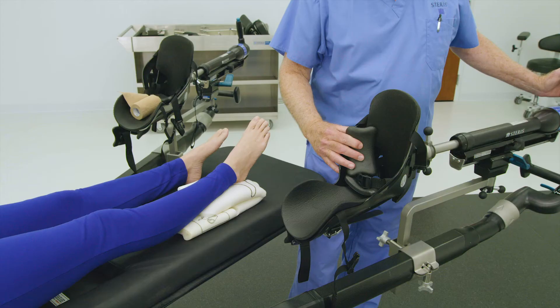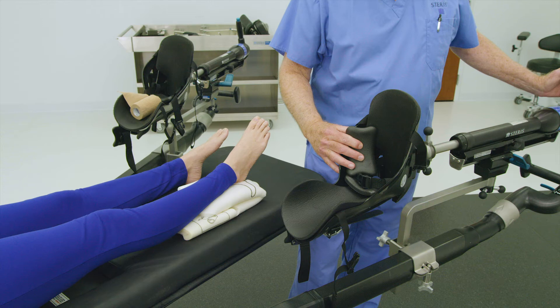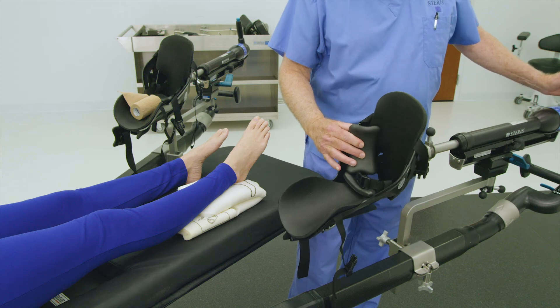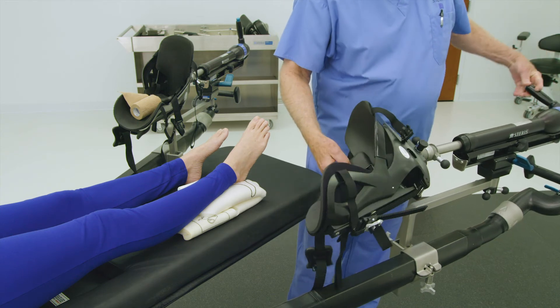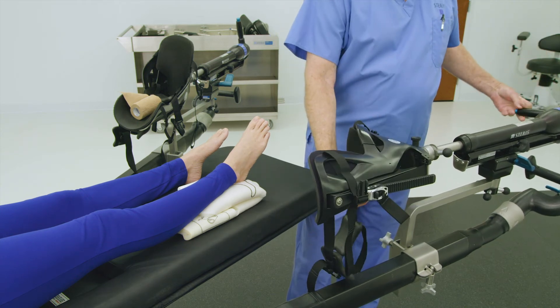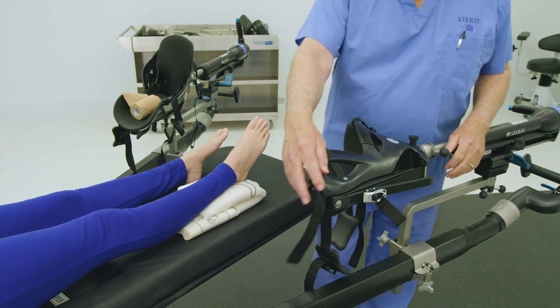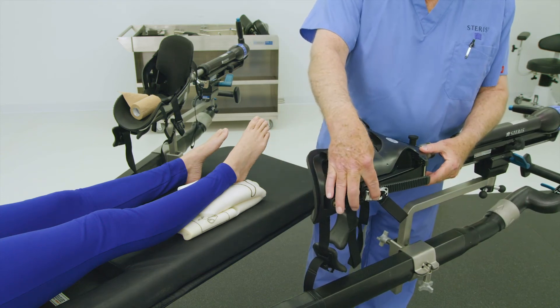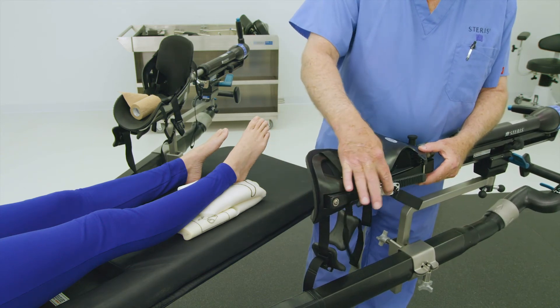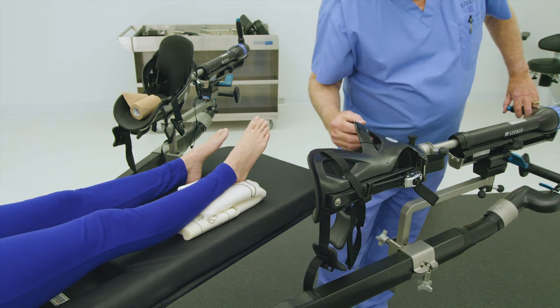Ensuring proper patient foot placement in the traction boot will secure the patient's foot when traction is needed. Complete the following steps to ensure proper alignment in the boot. First, loosen the middle strap of the traction boot by releasing the strap ratchet found on the back of the boot. Release tension by lowering the ratchet assembly to the bottom of the boot.